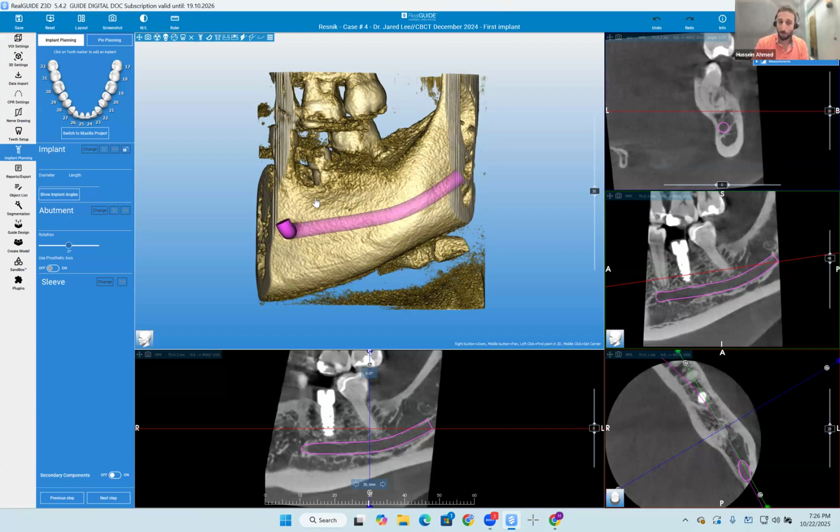What happened after this appointment is that Dr. Lee or his associate took out the implant sometime in January, grafted the site, left it to heal, and reattempted implanting a second time later in 2025, sir. I've got all the sequence of the CBCTs ready to be presented by Dr. Lee once he is here. Is Dr. Lee on? Yeah, I'm right here.